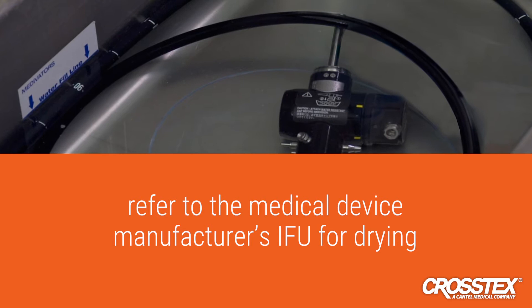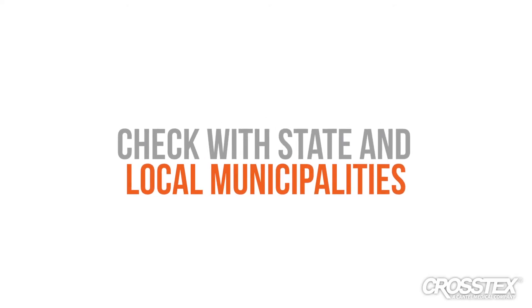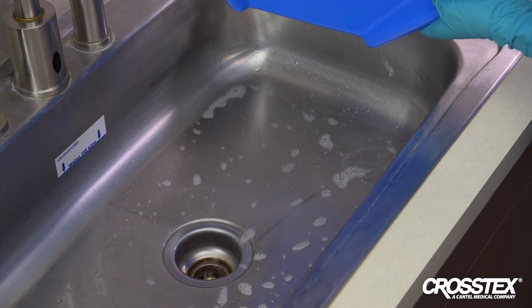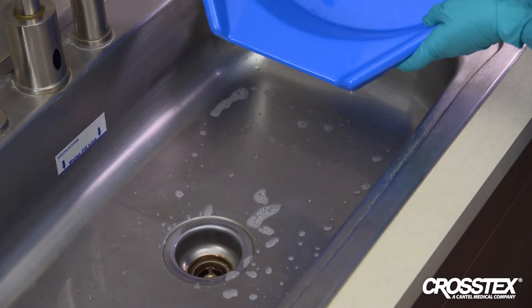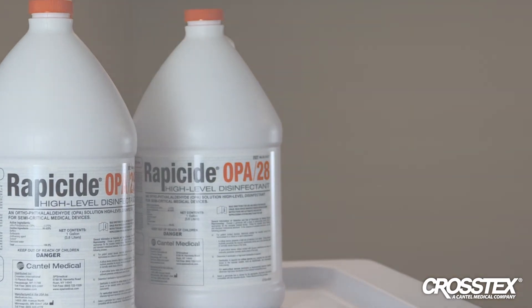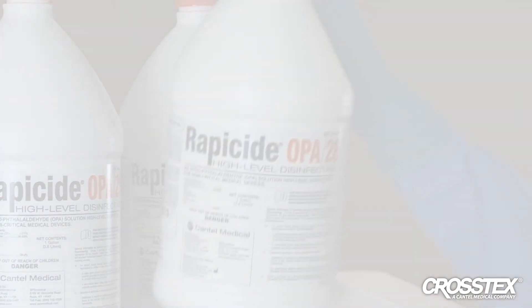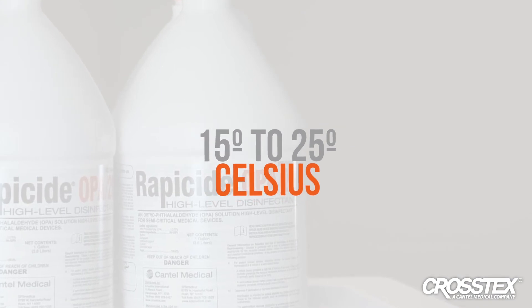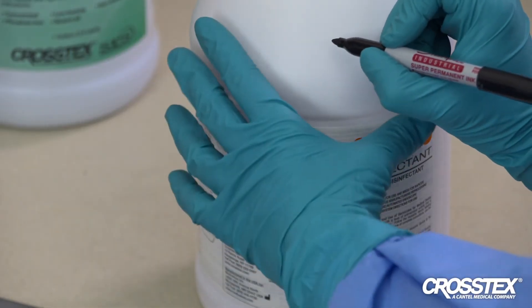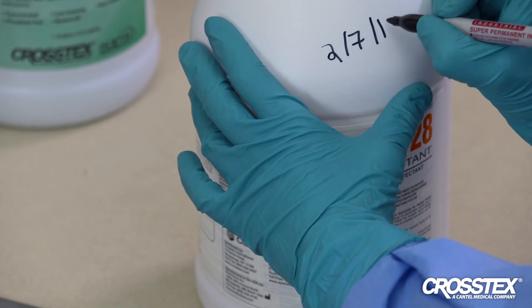Refer to the medical device manufacturer's IFU for drying. Be sure to follow any state, local, or department disposal regulations when disposing of Rappaside HLD. Unless otherwise specified, Rappaside OPA28 HLD can be safely discarded down the drain, making sure to flush thoroughly with water. Store Rappaside OPA28 in its original sealed container at a controlled room temperature of 15 to 25 degrees Celsius (59 to 77 degrees Fahrenheit) in a well-ventilated area. Once opened, the unused portion may be stored in its original container for up to 75 days until used.